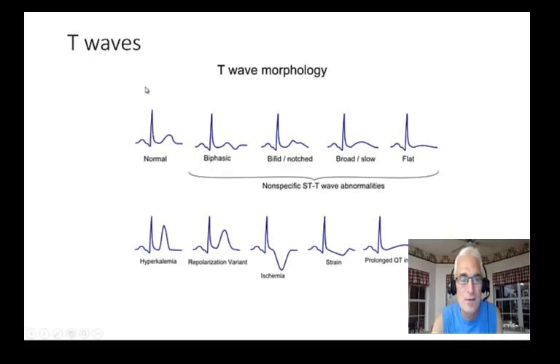Next up, T-waves. Remember, we have the P-wave, QRS, and then the T. The T is the repolarization of the ventricle. There's a nice normal upward T-wave. There's a biphasic T-wave. What does that mean? Sometimes it's a normal variant. There's a notched T-wave, broad T-wave. You might see some with hypokalemia. Flat T-wave, low potassium hypokalemia. Now look at hyperkalemia, look at that peak T-wave.